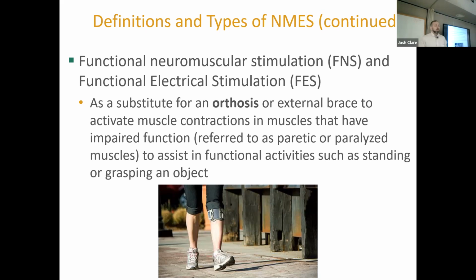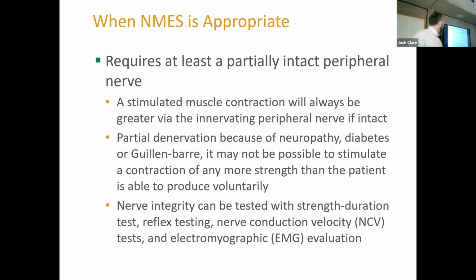Yep, could be. And then there's one other big thing. What did we learn about the guy with the burns? The risk of burns, right? So if they're going to be walking around with this all day long, there's going to be risk of those electrotherapy injuries.